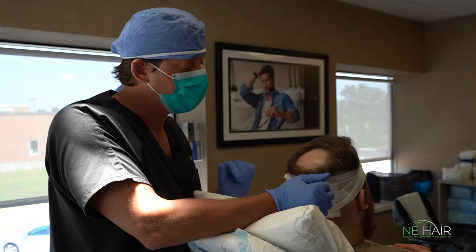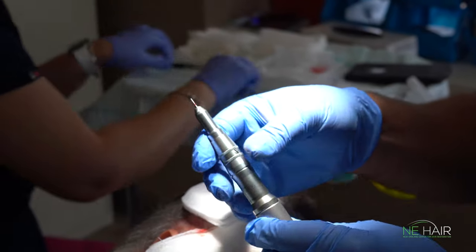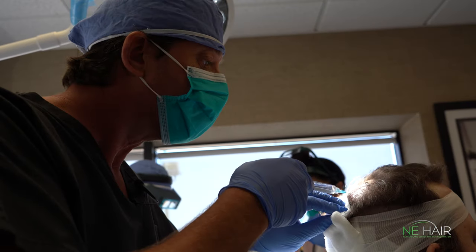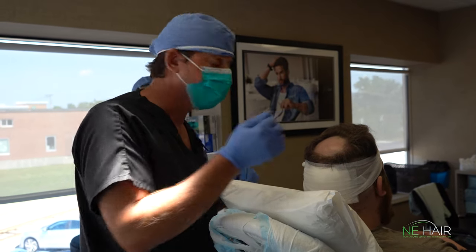We've isolated all our grafts from the back by follicular unit extraction. We used a 0.9 millimeter punch to do that, so we had micro incisions. Now we're going to take those thousands of grafts and put them in through here. I'm just going to numb this up a little bit more to make sure our patient is nice and comfortable, and then we'll make all the incisions.